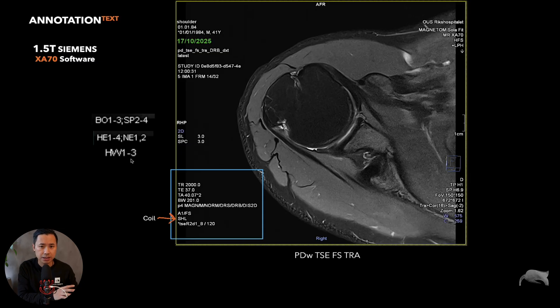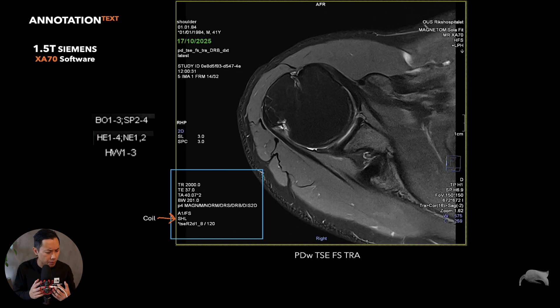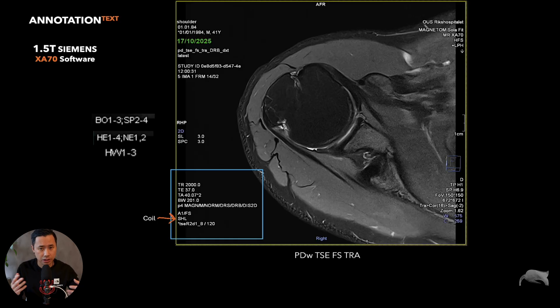This is good to know if you get bad images - just look in the corner and check. I remember putting on the body AT coil and suddenly it didn't show anything there, which meant it was not activated or it didn't work.